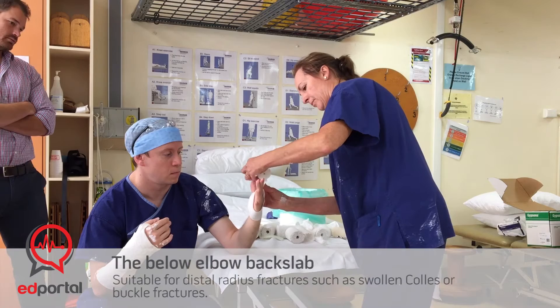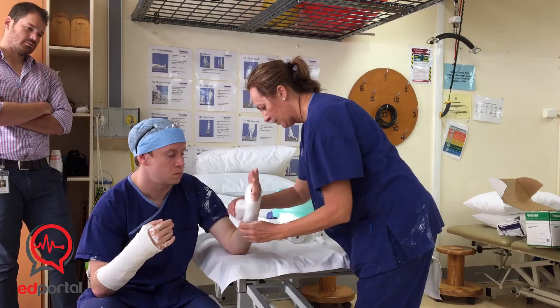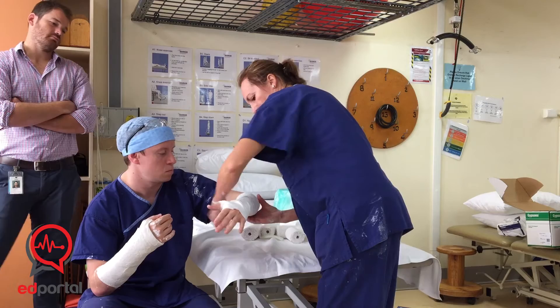So that's the same wrapping method. You're going further down on where the cast is going to finish, and you're going to trim up those edges.